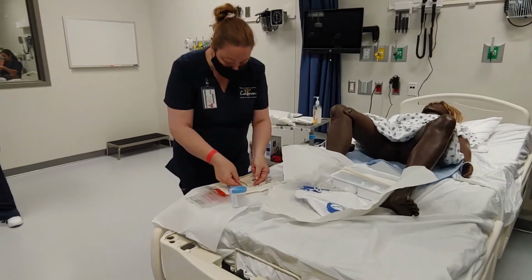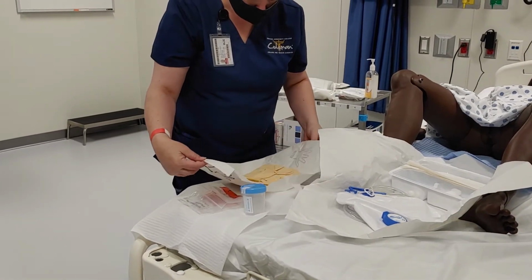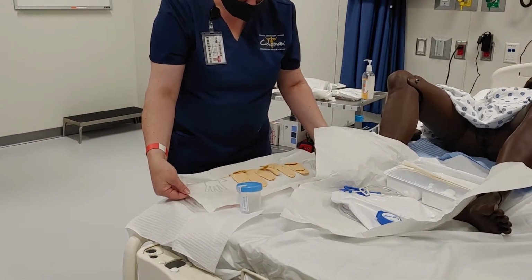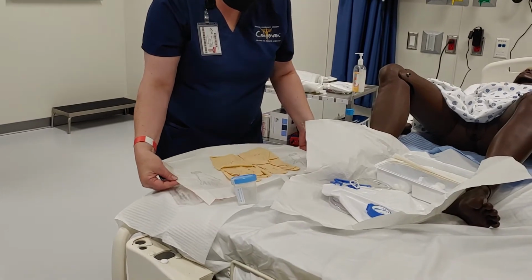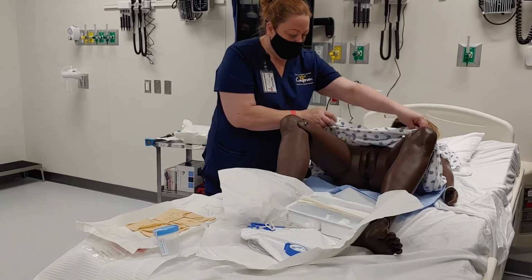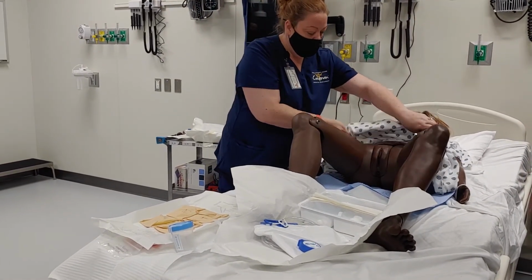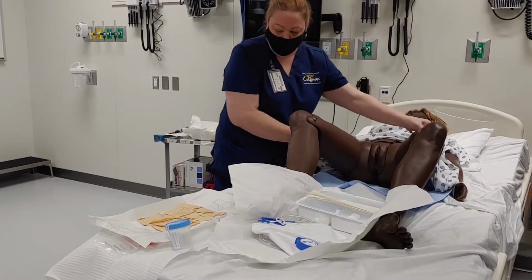I'm going to go ahead and put on my sterile gloves. And again, you guys know how to do this. We did it last week. I'm going to pull this up and just tell them, make sure that my curtain's pulled for privacy, okay? I'm going to expose that perineal area.